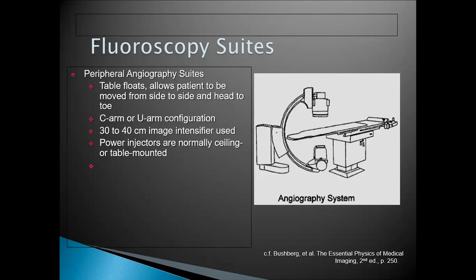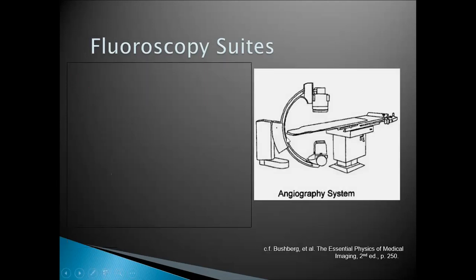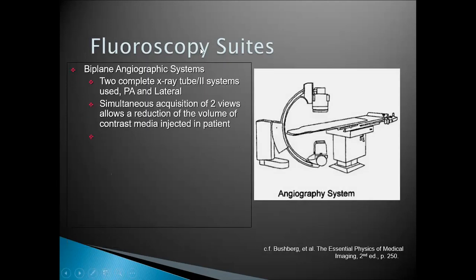These are some angiography systems. Now the biplane angiography suite. This one has two X-ray tubes and two image intensifiers.